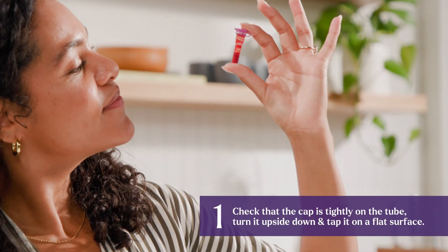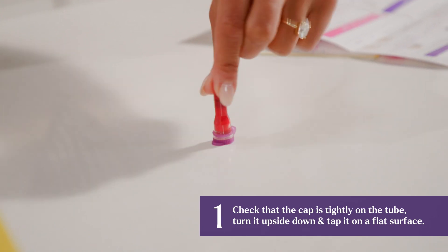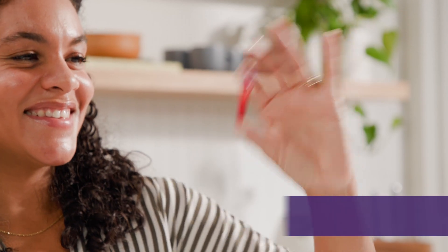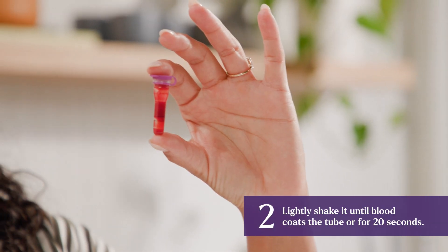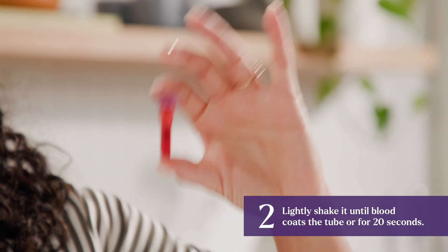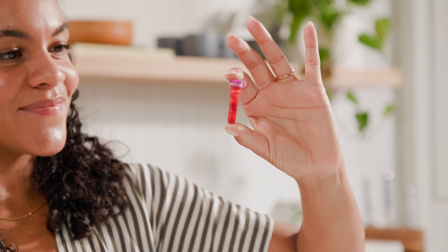Check that the cap is tightly on the tube, turn it upside down, and tap it on a flat surface to break up blood clots. Then lightly shake it until blood coats the tube, or for 20 seconds — whichever comes first. Repeat the process until blood coats the tube. This step mixes your blood sample with a preservative that keeps it in great condition during transit to our lab.